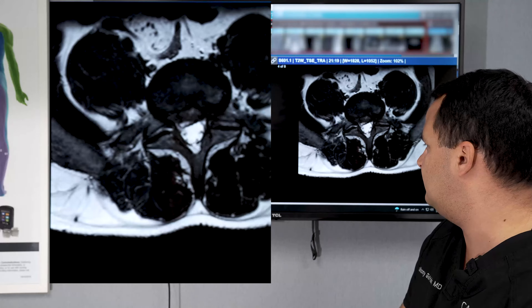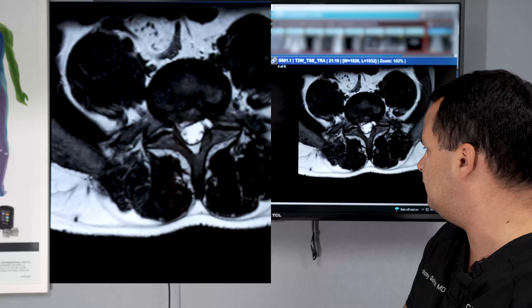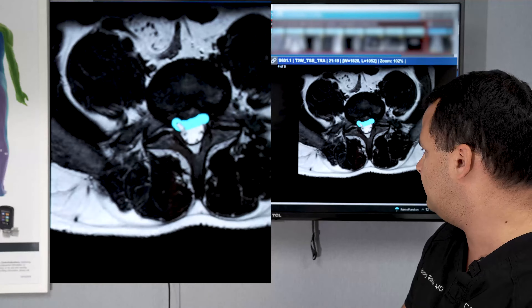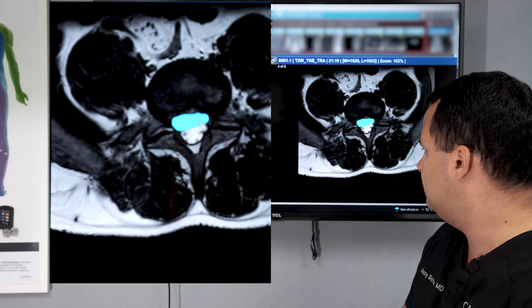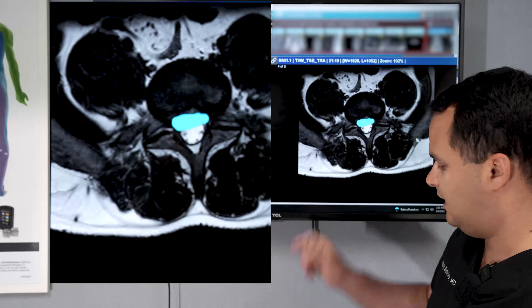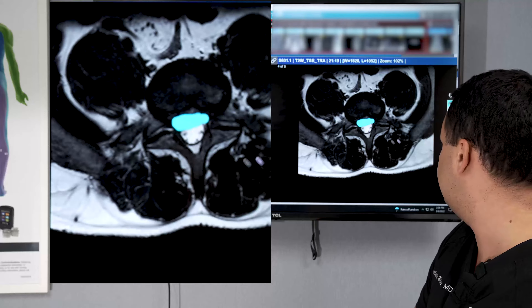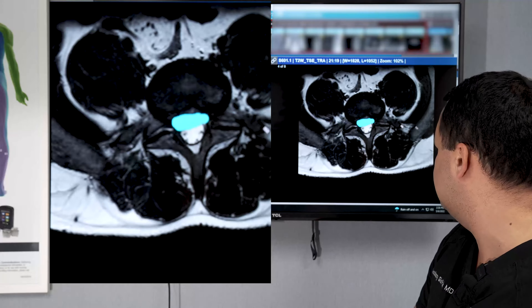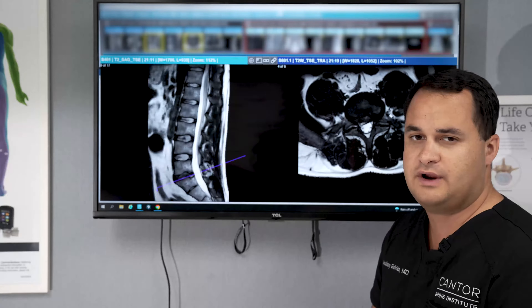What really matters here is this little piece right here. This disc that I'm highlighting in blue is pushing out onto the right side, pushing onto the nerves that go to the patient's legs. If we erase the highlight so you can see it a little better — this white part here is pushing out, pushing on that nerve going to the right leg.